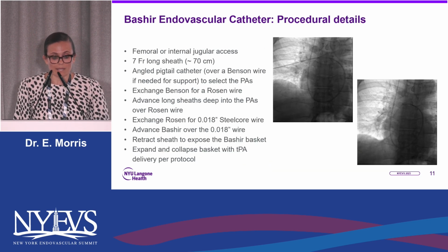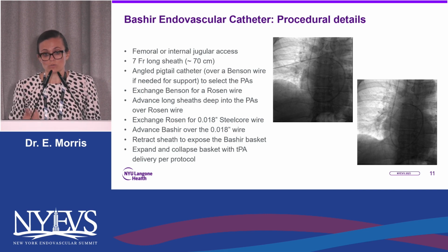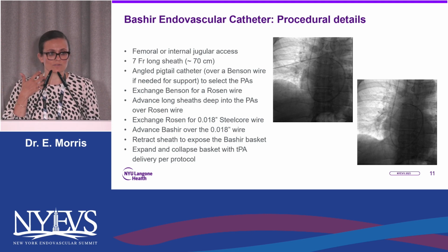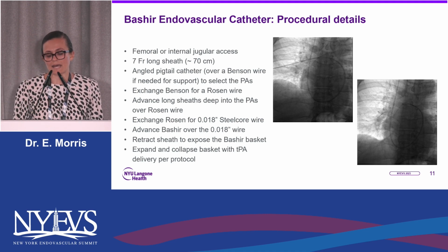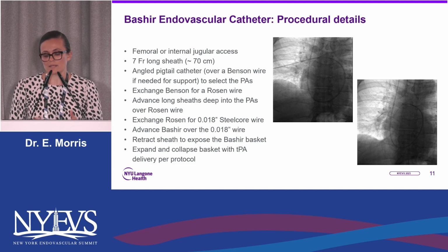So the way I do these cases, you can do them femoral or jugular. I like to do a unifuse case jugular. I think it's a little more comfortable for the patient when they've got a lysis catheter sticking out of their neck for 24 hours. But the difference here is that, and you'll see in subsequent slides, the infusion time is only 5 hours, which means that you can dwell the patient in your PACU and then bring them back and take out the lysis catheters.